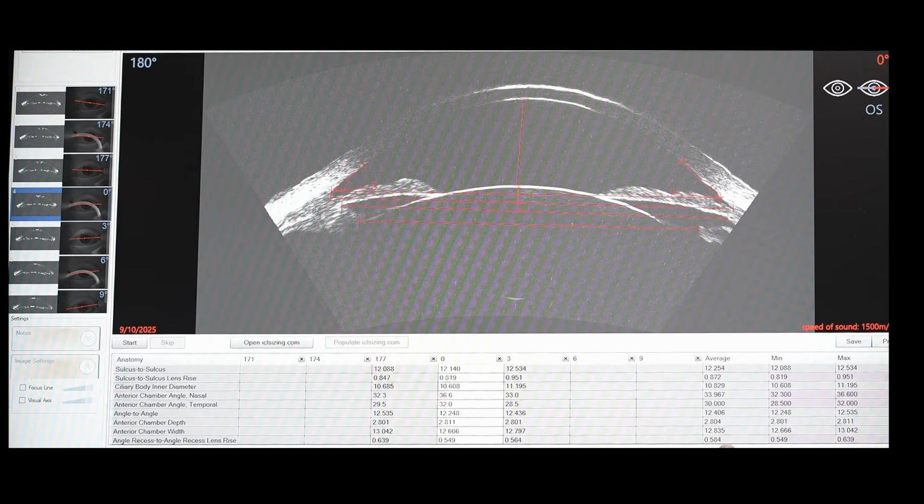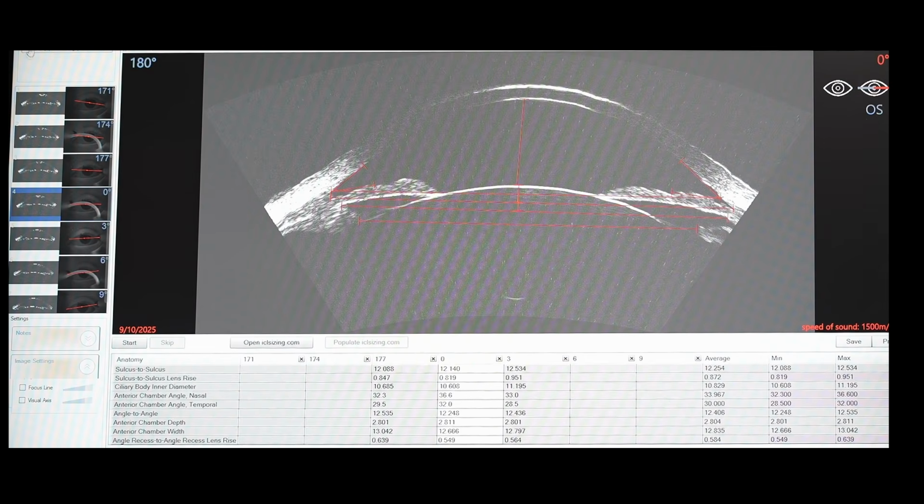And these measurements I'm going to record in an Excel sheet. Dr. Jack and I share an Excel sheet of all of the ICLs that we've done, and we have all of their previous measurements in there so we can compare ICL sizes from before and what has worked, what hasn't worked as well. So I'm just going to record all of that. And then I also repeat this for the other eye. So this was the left eye, and I just go back to the patient information and pick the best photo for the right eye and repeat that again for these three images.